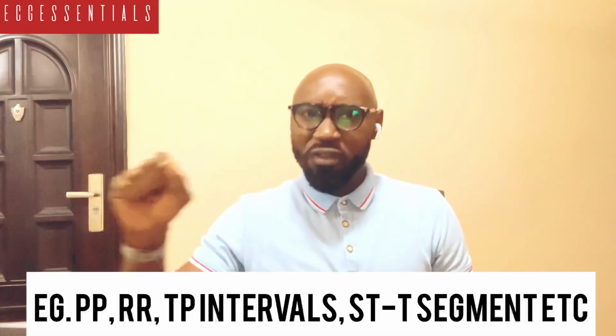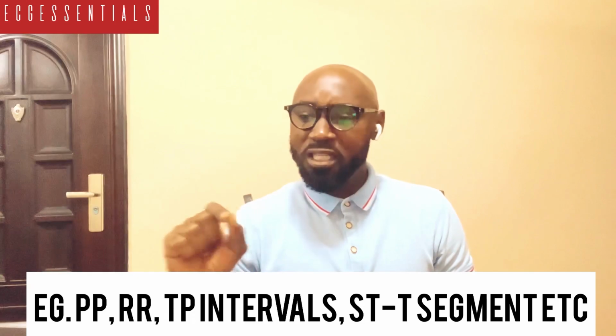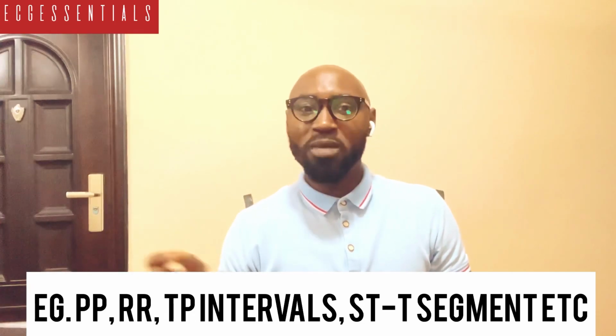Similarly, we also realize that for the intervals and the segments as well, there are more of them, like the PP interval, the TP interval, the STT segment, etc., that, of course, senior colleagues may make reference to. But luckily for you and me, ECG Essentials will be focusing mostly on the usual waves and the straight lines and segments that we see on the ECG. So do not panic at all.